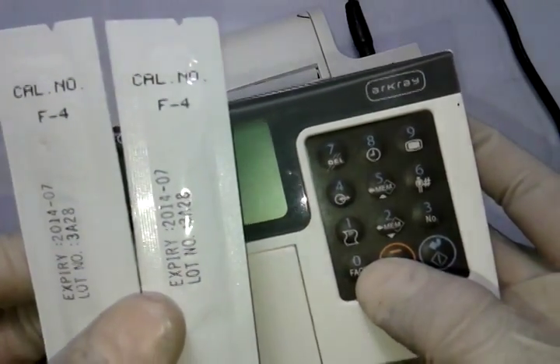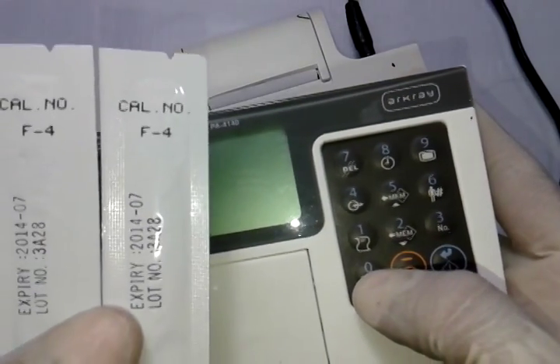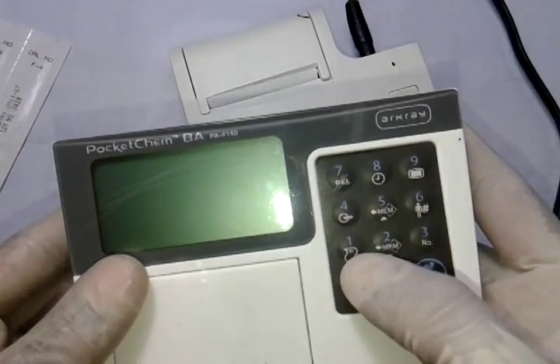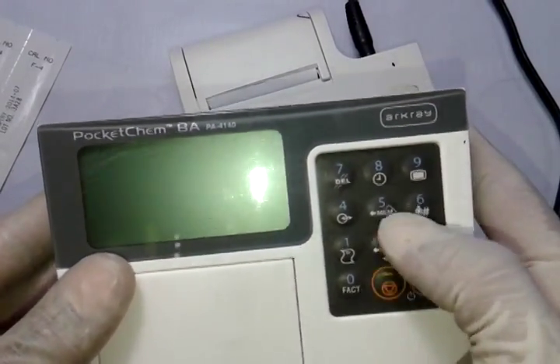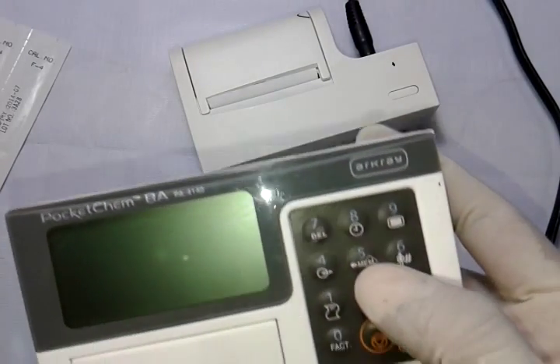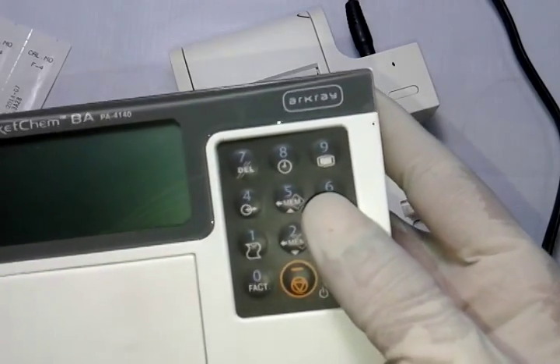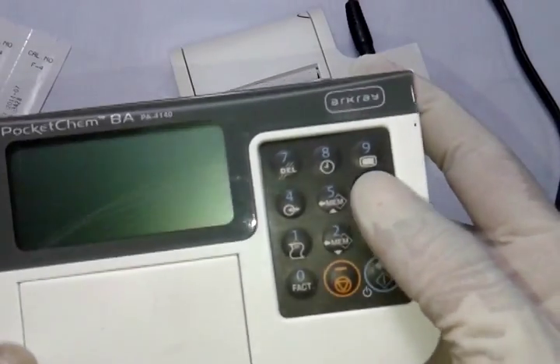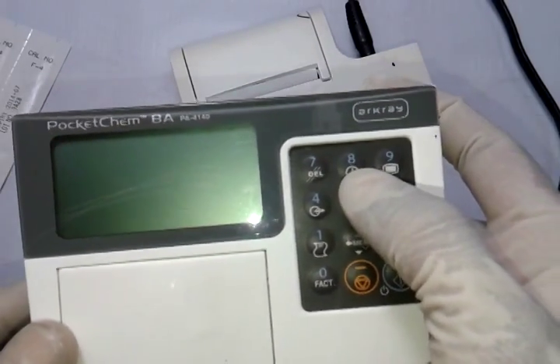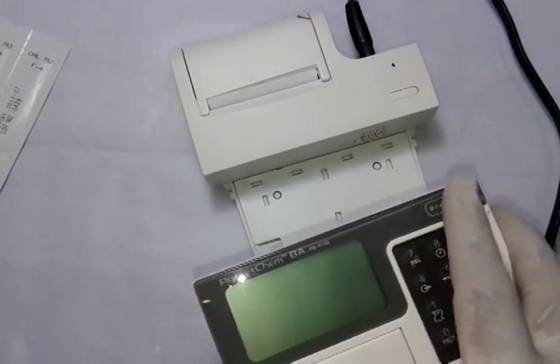Every time you have a different batch of strips, you must feed in the code number before performing the test. Button one is for paper feed, two for memory, five for memory scroll up and down, six for patient ID, nine for quick test report, eight for clock readings, and seven for delete.